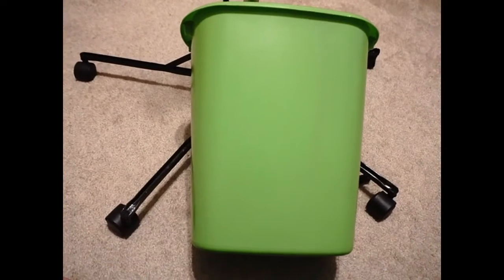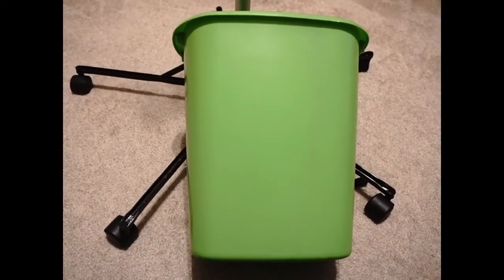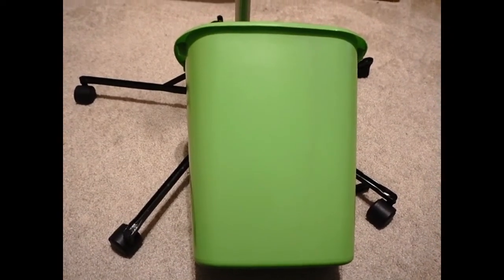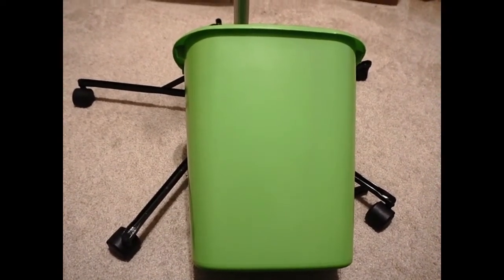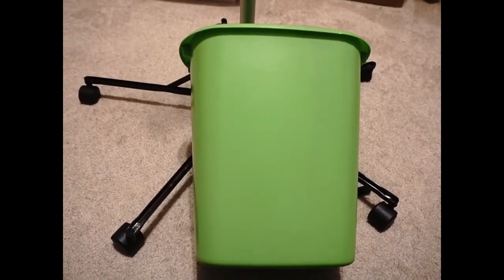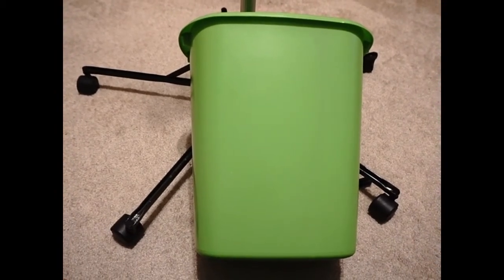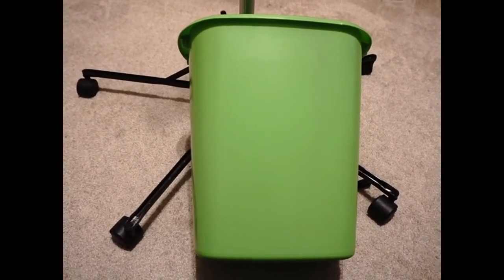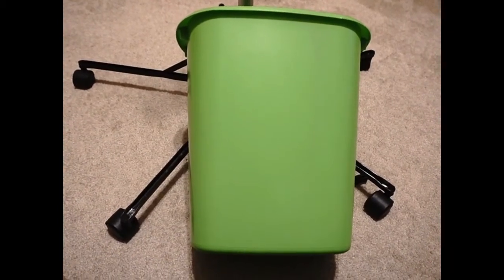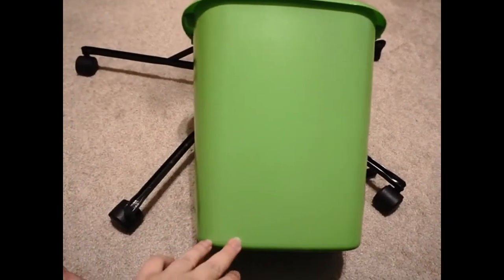The IV pole we have is just the standard travel fold-up style. I did one for her ventilator pole which is a different size, and then we have a standard IV pole like the hospitals have which is a slightly different diameter too. We'll go through all that — so you'll need your IV pole and your garbage can.